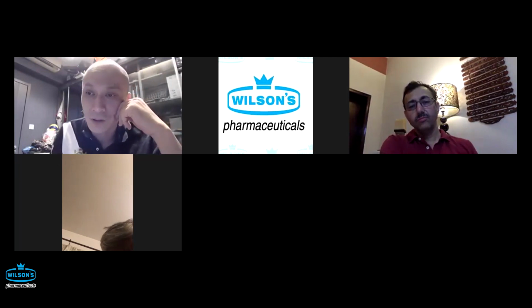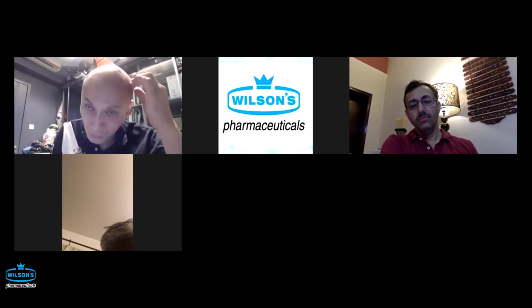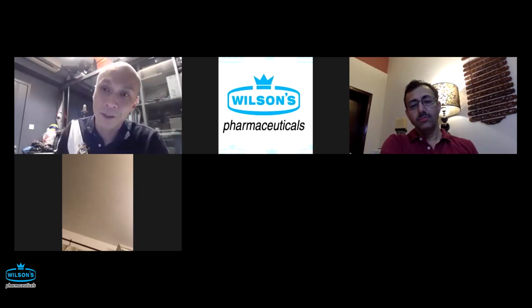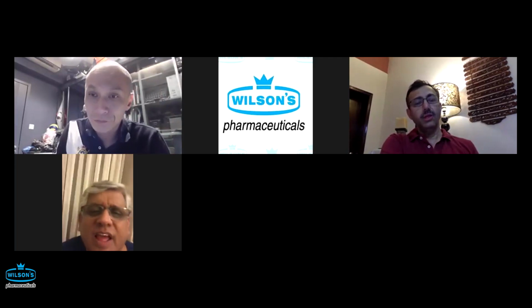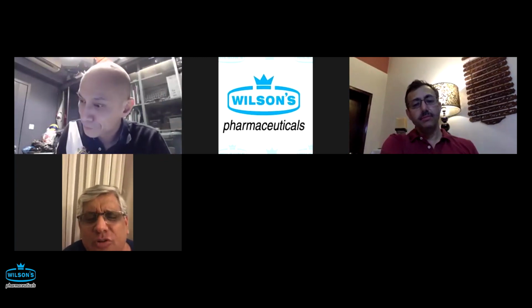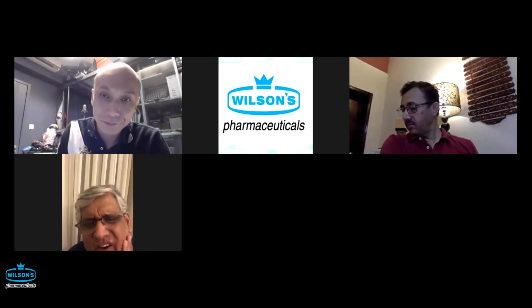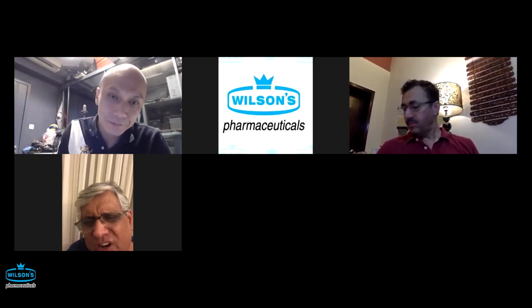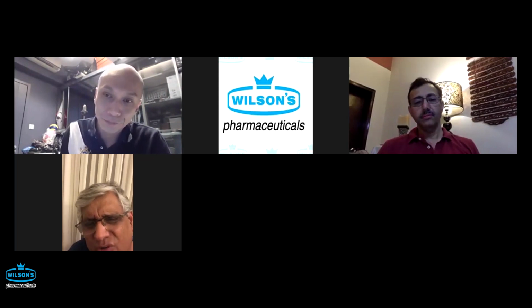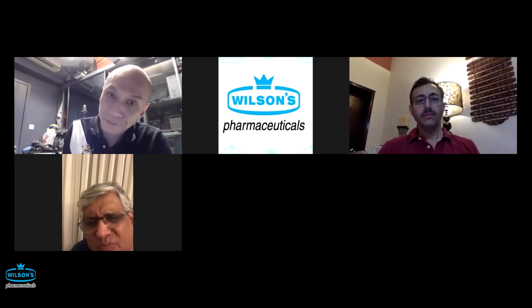There are studies showing 1 minute versus 5 minute dilation, and actually, if you keep the balloon on for a longer period of time, the risk of pancreatitis can also be lowered. So that's one thing you can try to practice. Anthony, do you always do sphincterotomies, because your intention is to remove the stone, and then you do a sphincteroplasty? In our experience, once you've done a good but adequate sphincterotomy and you do a sphincteroplasty, other than the procedure itself, the sphincteroplasty doesn't actually increase the risk of pancreatitis.